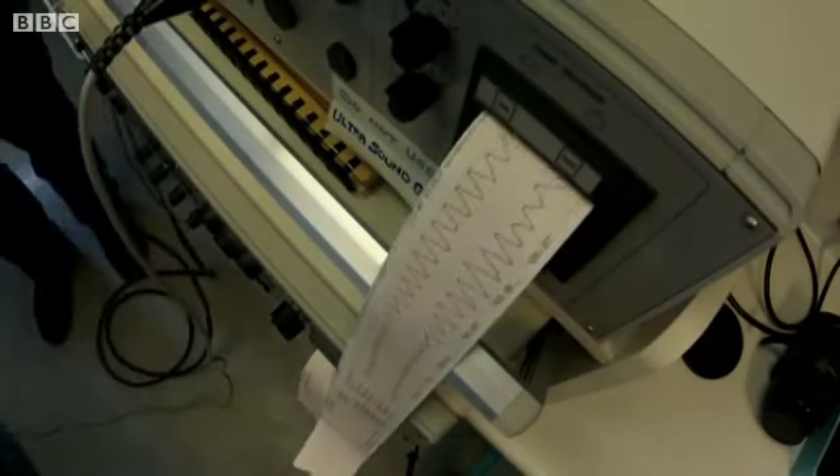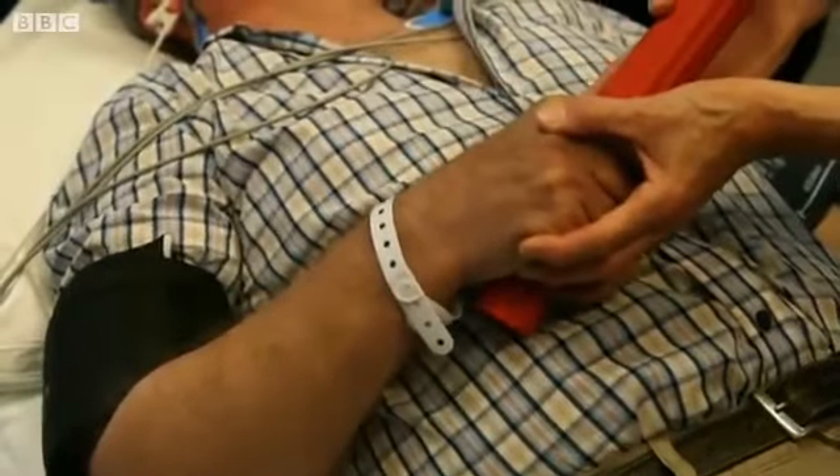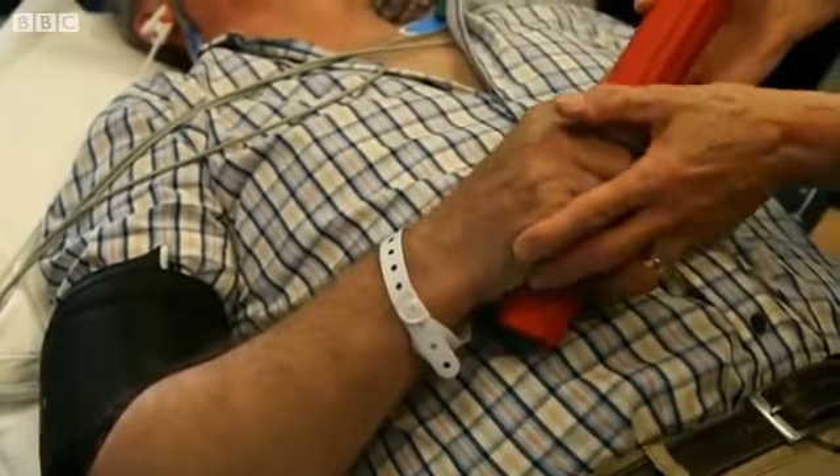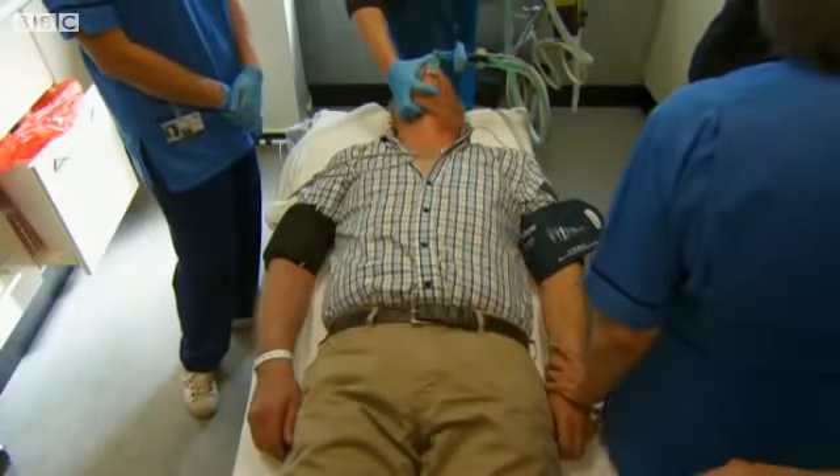That's about 25 seconds on the EEG — that's good.